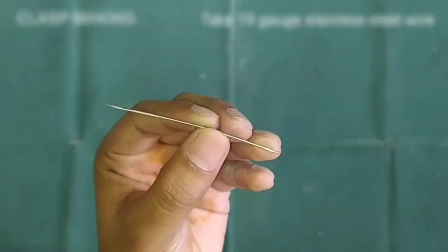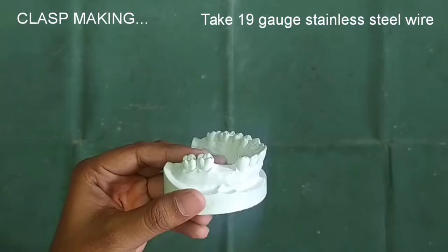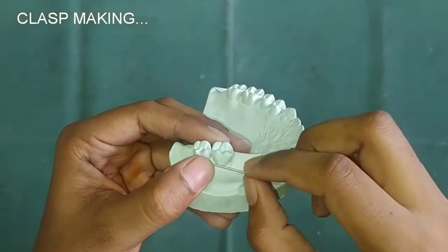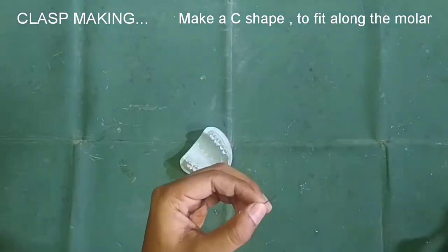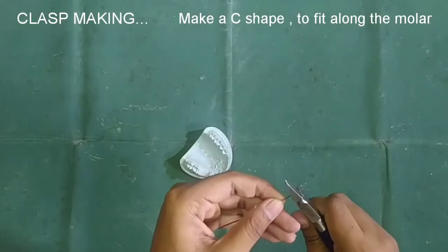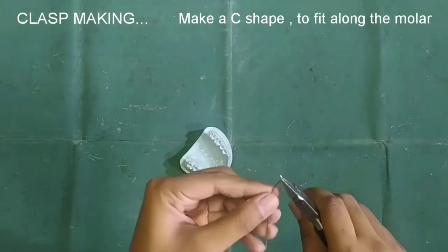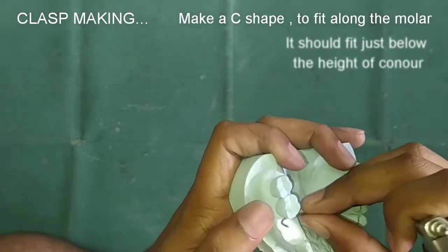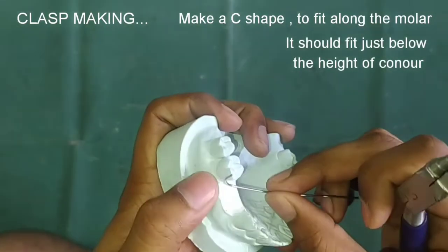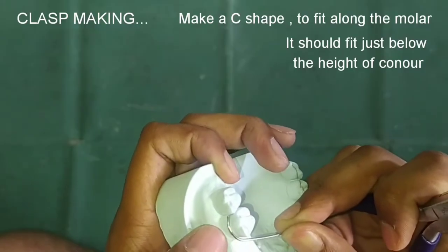After this we will make the clasp. We are going to make the C-clasp here with the 19-gauge stainless steel wire. Take proper measures and make the C-shaped arm. Our C-arm should fit in the buccal portion of the crown almost at the height of contour or just below it.